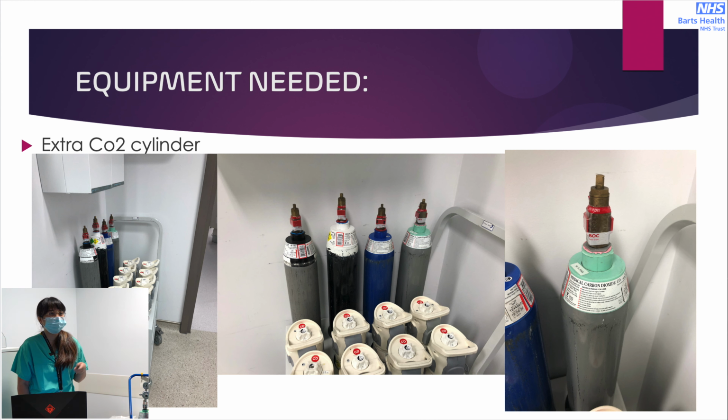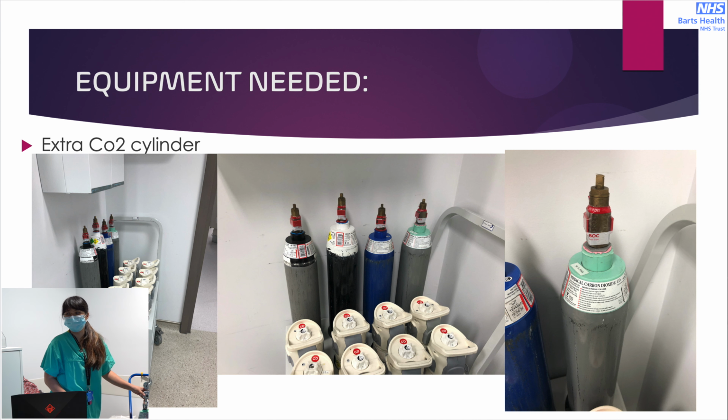Which one of these is the CO2 cylinder? The green one. Please make sure you get the correct CO2. I don't know how to change the gauge. I don't know either, but the ODPs know.